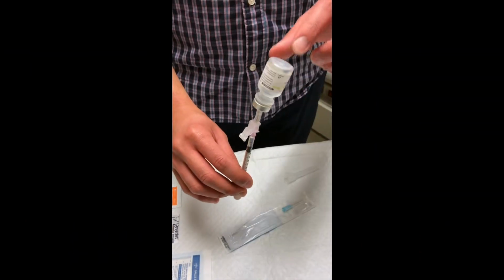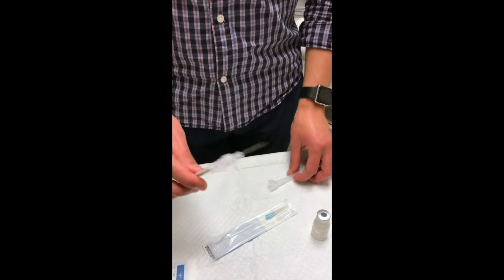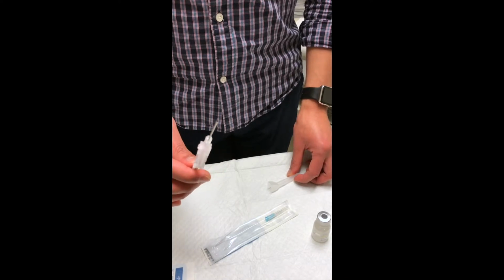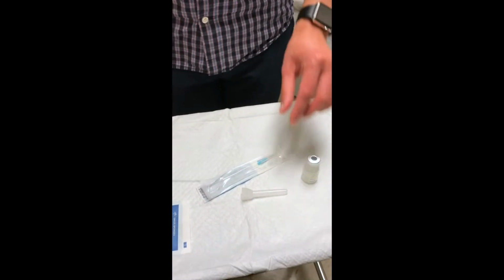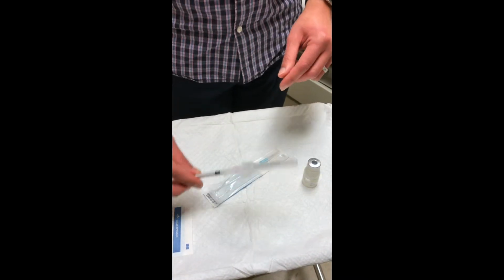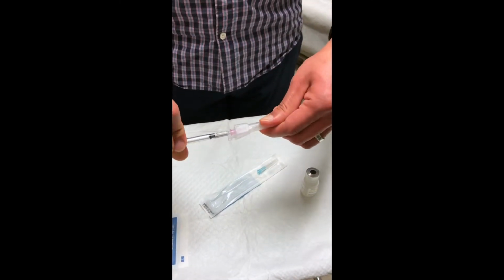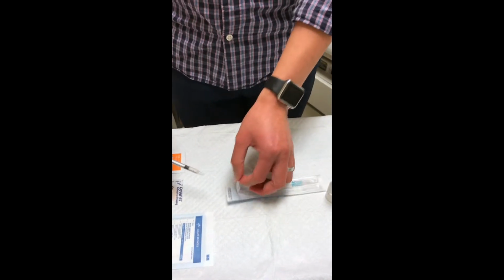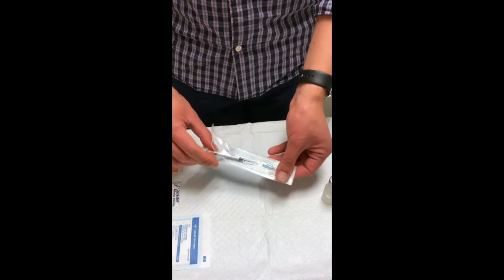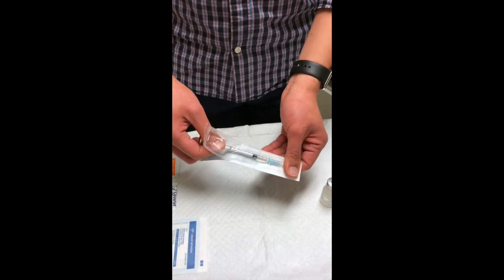Now that we have our right dose, we can switch out our needle to the one that we're actually going to use to inject. Because that is a pretty big, scary needle, one thing that you can do to help minimize accidentally poking yourself is to get the cap, put it on the table, and just use the needle to scoop it. That way you don't accidentally poke yourself. Twist it off, lefty-loosey. You can set that aside, and now you can put on the needle that you'll be using to inject. Righty-tighty, you hear the squeaky noise, you're set.